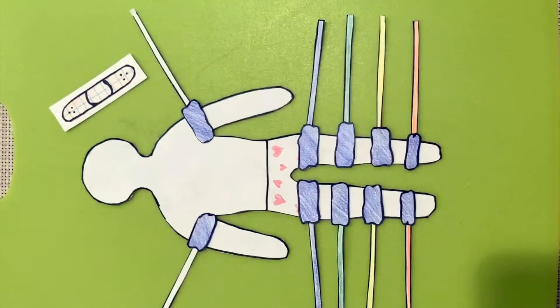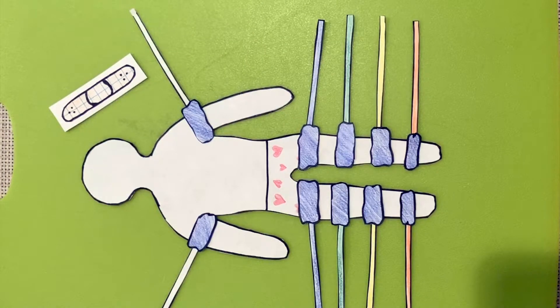You will repeat the same process with the ankle cuff with the posterior tibial artery behind the medial malleolus.